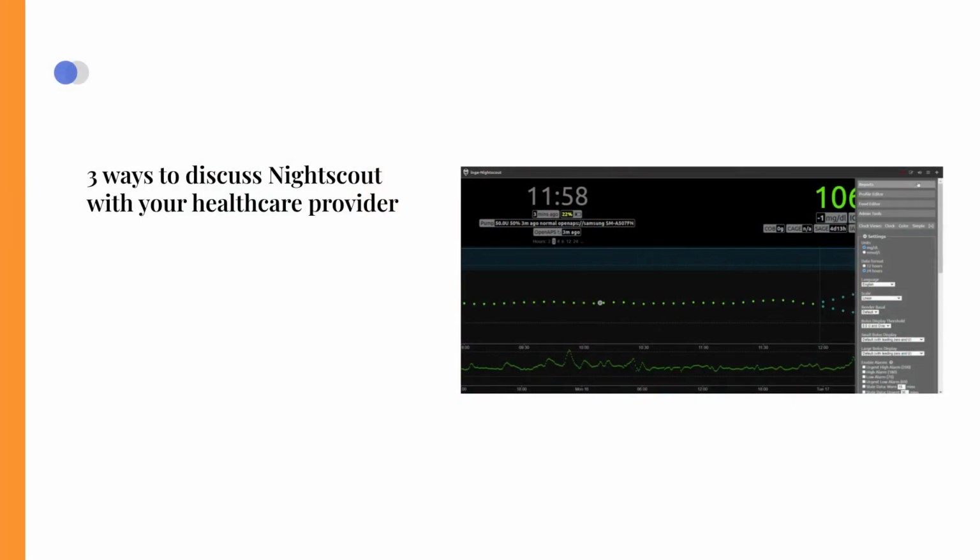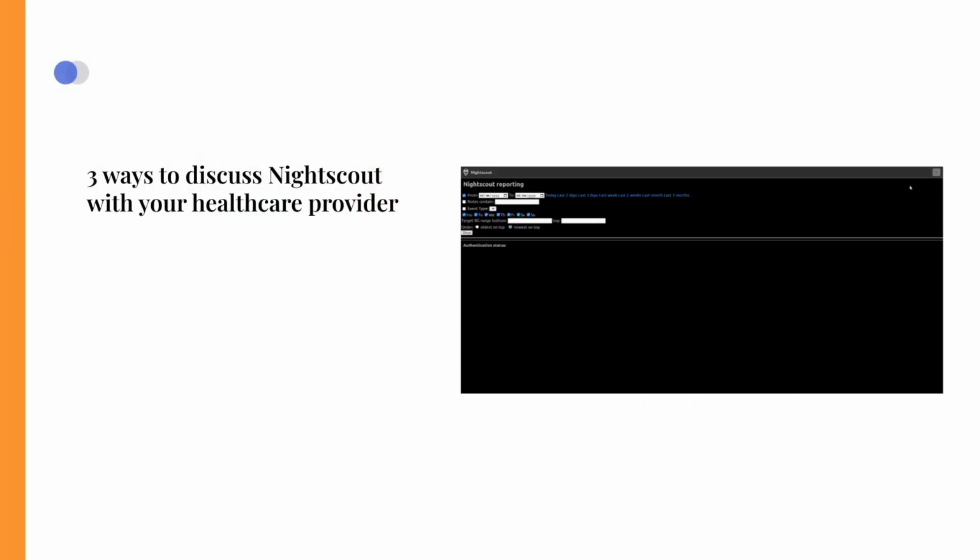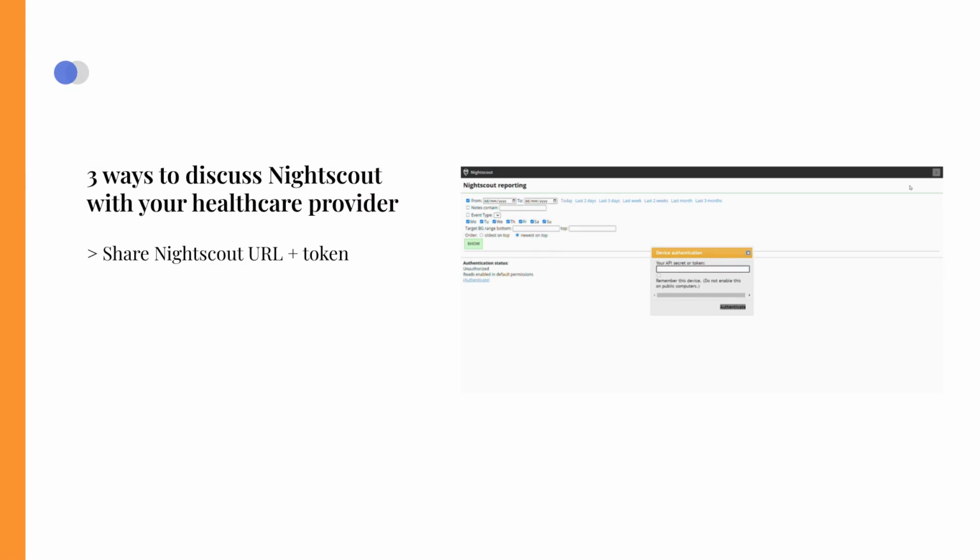There are 3 ways to discuss these reports with your healthcare provider. You can provide your healthcare provider with your Nightscout URL and a secure token that you have created. This allows them to access and view the reports directly.